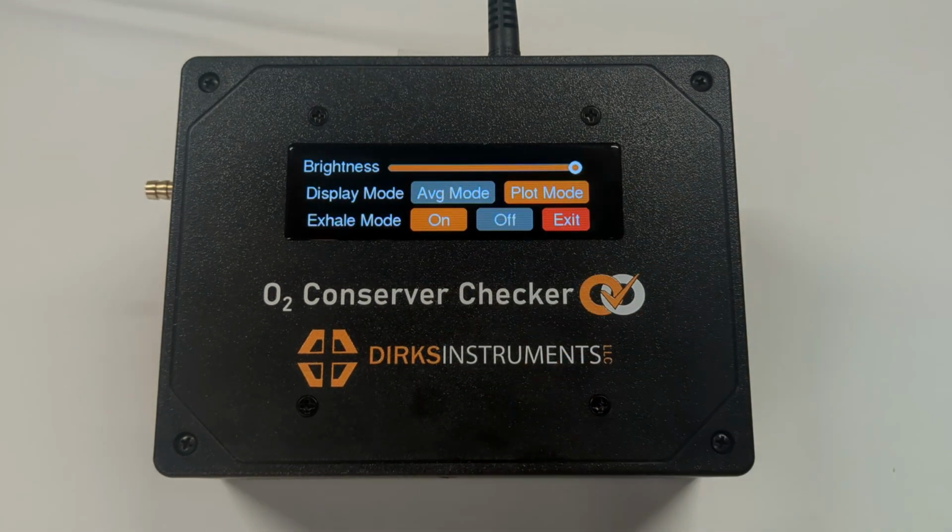Our last setting in this menu is the exhale mode. Some devices require a positive exhale signal before they will trigger another pulse. For these, you have to make sure that the exhale is turned on.